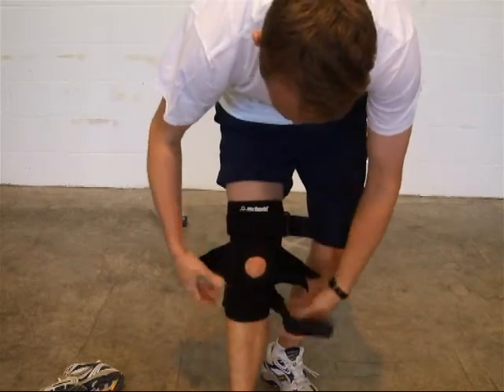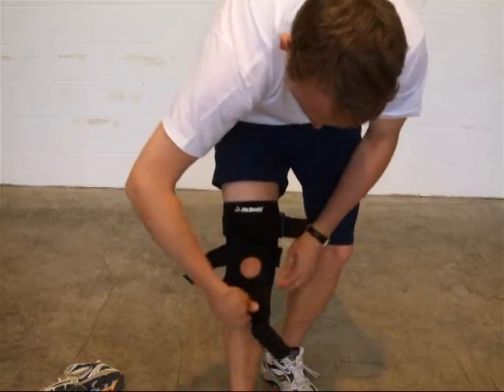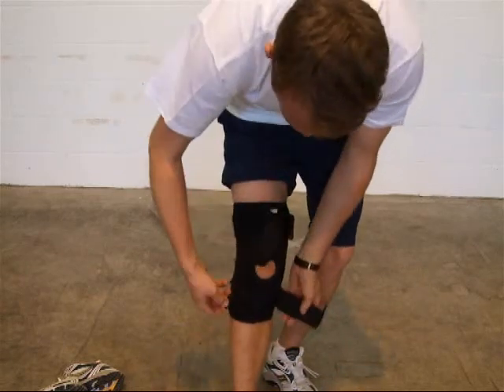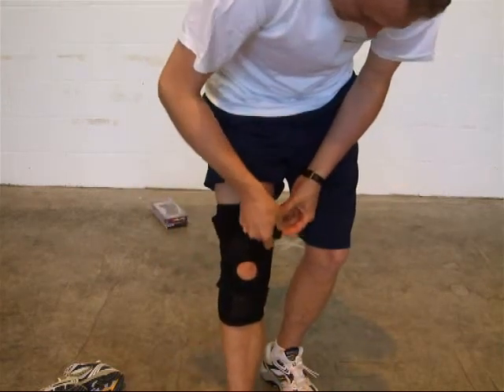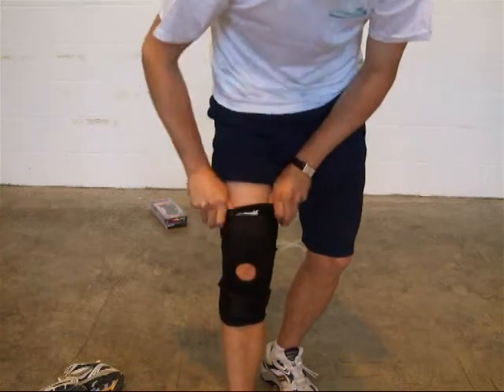You then do up the elastic cross braces at the top, then do up the rear of the bottom and the top support — tight but not too tight, and that's it.